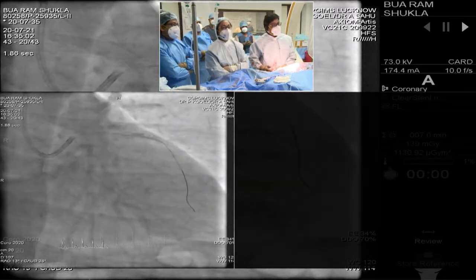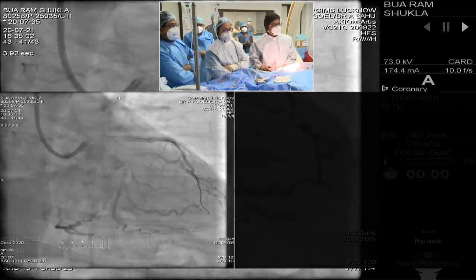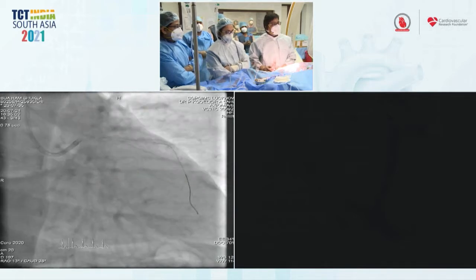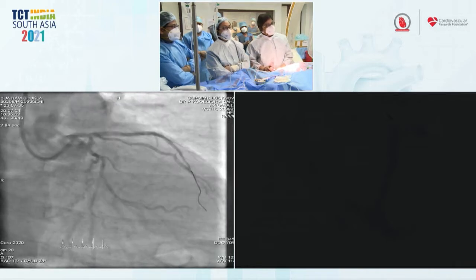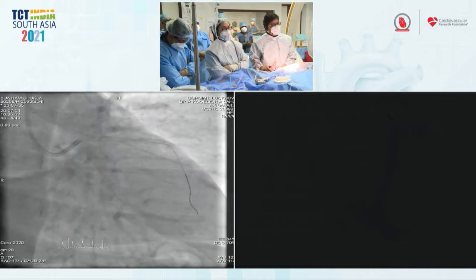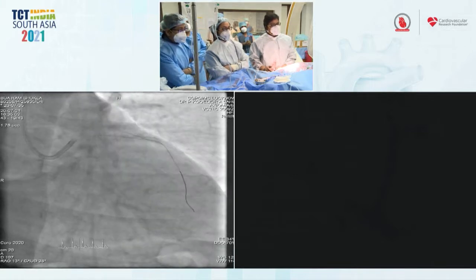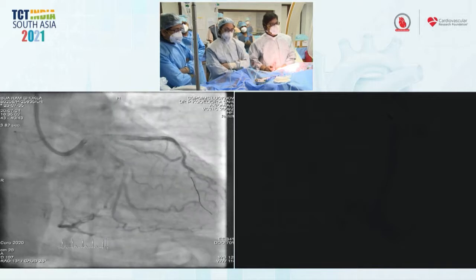So let me ask some of the panels. Dr. Mustafa, after fixing the LAD, and if the patient has a significant improvement in anginal symptoms, what is the utility of the RCA CTO in that situation? Would it be something that you would do routinely, or reassess symptoms? Especially in this case, considering the patient's age, he's 83 years or so, and if the symptom has significantly improved, probably I may not venture into the RCA. And especially the RCA looks like a CTO, so it's not going to be an easy RCA. But at the same time, if the patient continues to have this angina, I may attempt the RCA.